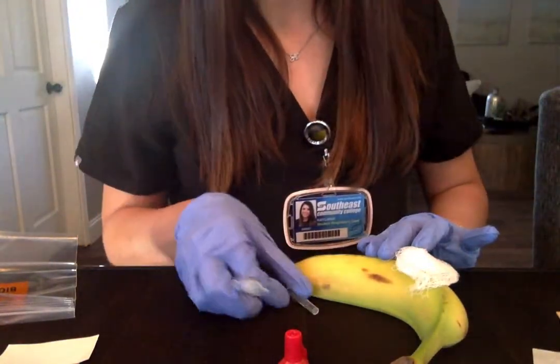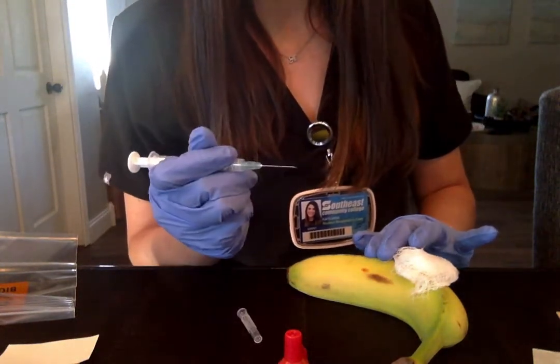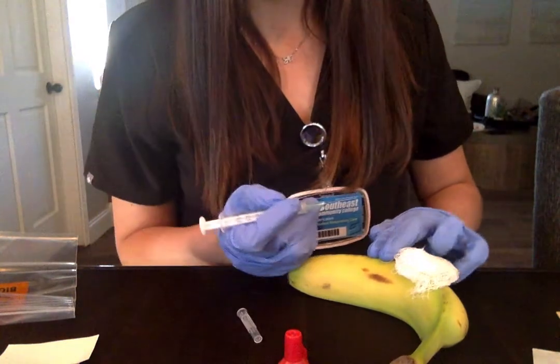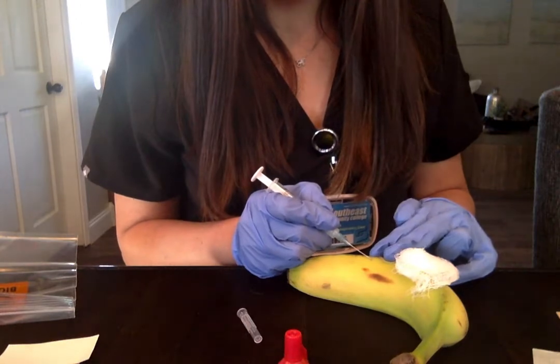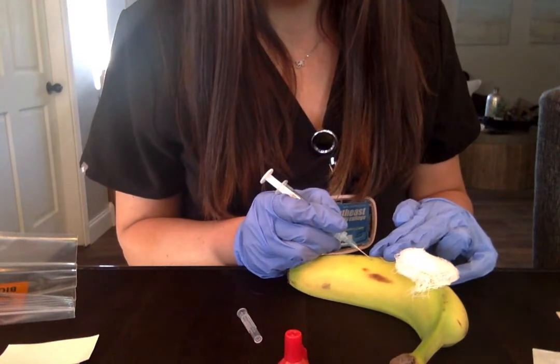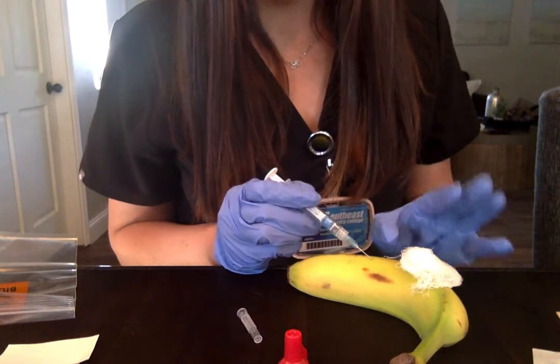I'm going to grab the gauze. Once I find the artery, I'm going to slowly insert the needle at a 45-degree angle, holding it like a pencil, with the bevel side up. So I'm going to slowly insert that, and this was drawn back to the amount of blood that we want from this patient.